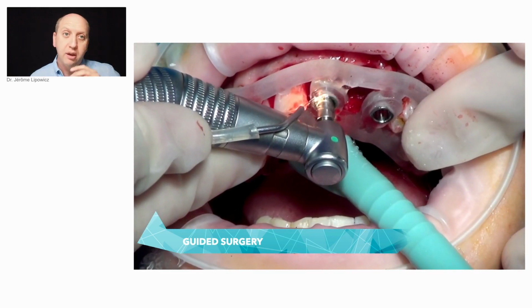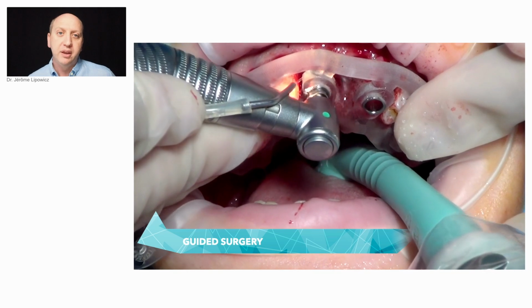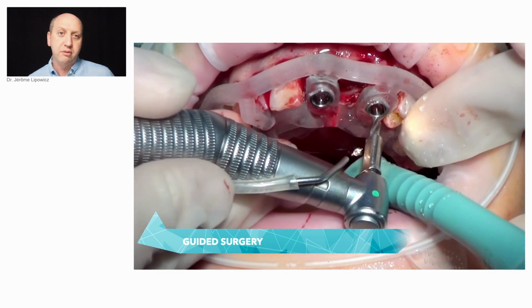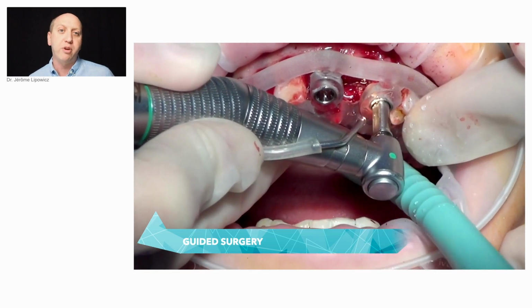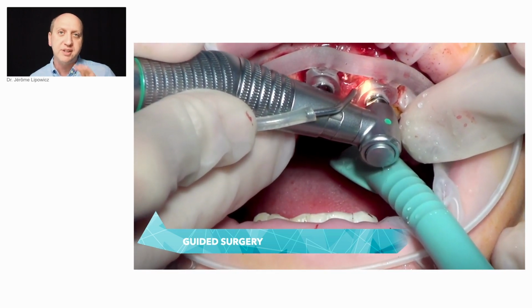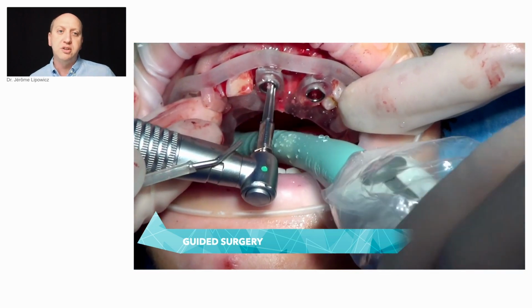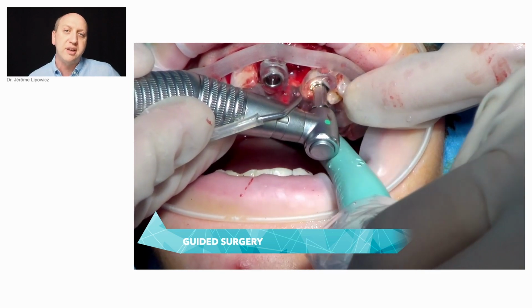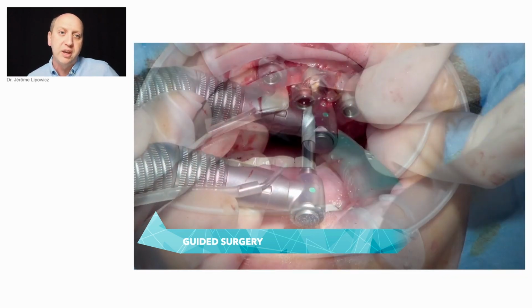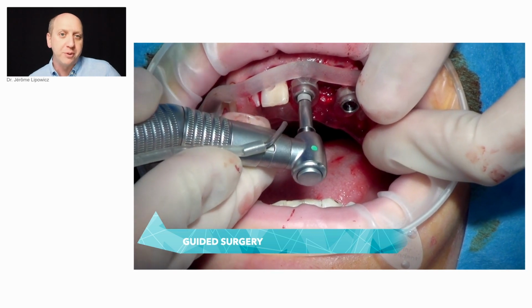And of course, all these tools are intended to use guided surgery. It is for us a centerpiece, a mandatory step. However, we'd like to again alert about the accuracy of this technique, because we still too often meet colleagues who have rejected guided surgery because they encountered difficulties and disappointments on the first use in terms of ergonomics, sensations, and the final outcomes.